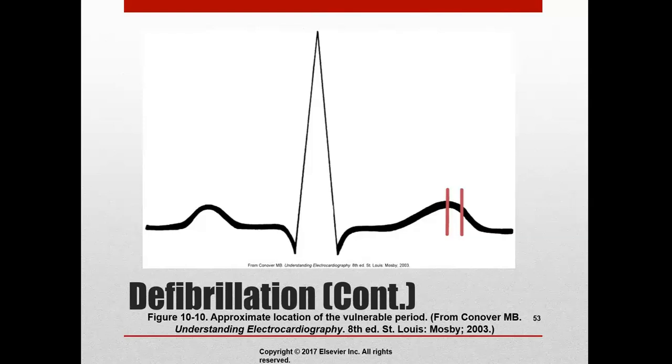Okay, so it's important that we talk about the difference between defib and cardioversion. So we need to prevent shock on the vulnerable T wave during cardioversion. Defib is an asynchronous delivery of a high energy shock, okay?